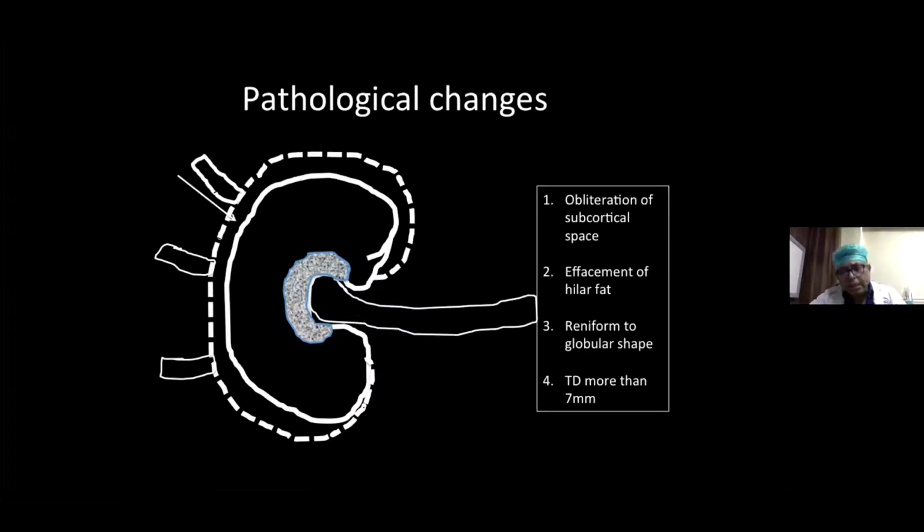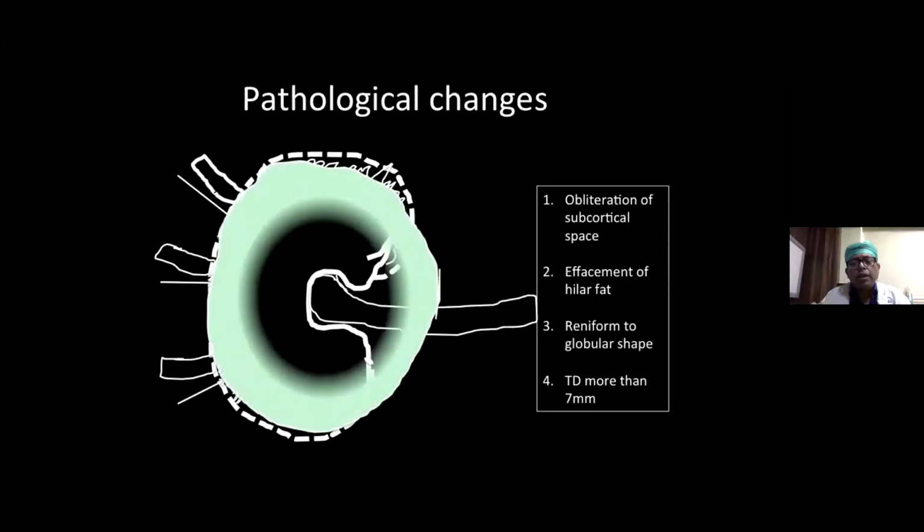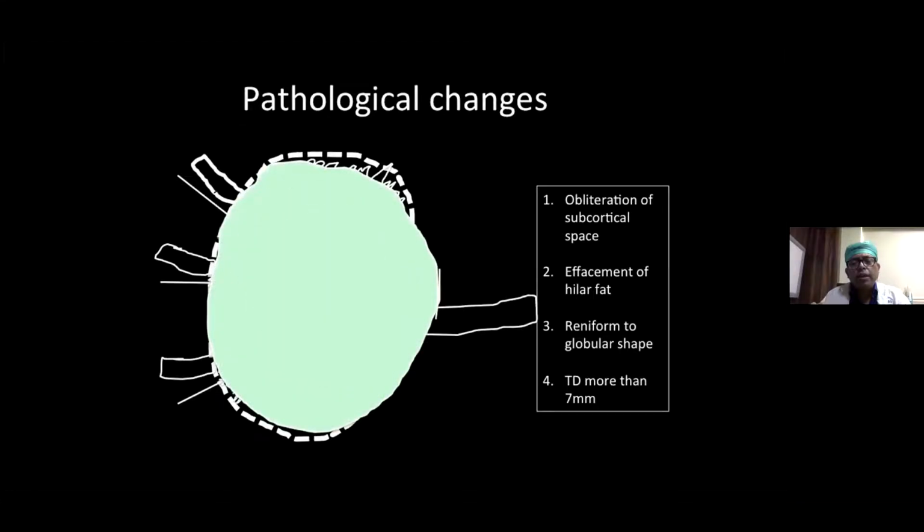the malignant cells start going into the cortex. So the first thing which most of you do not know is a cortical thickening. And that is because the malignant cells are going to fill up the subcortical space. And at this stage, the hilum is not going to be effaced. And look at this, it comes later on, the hilum gets effaced, because now the exit route is also blocked by the lymph node. So this is a classical feature of an axillary metastasis.